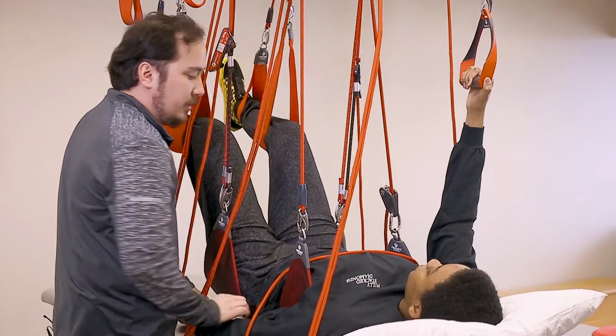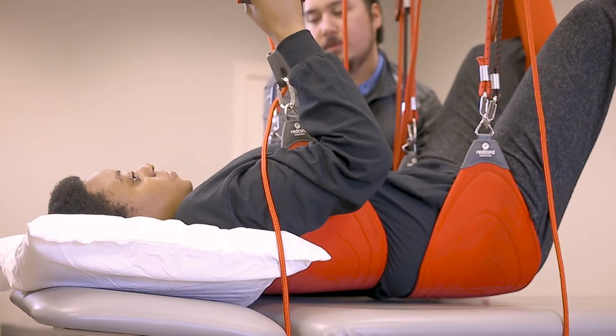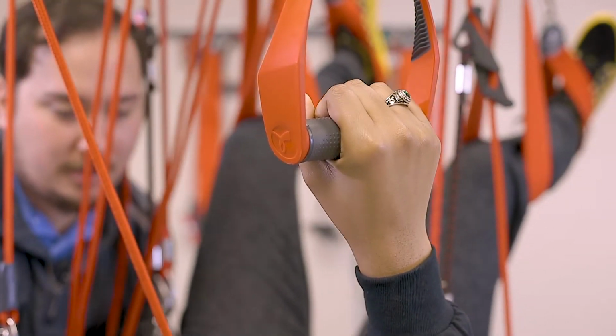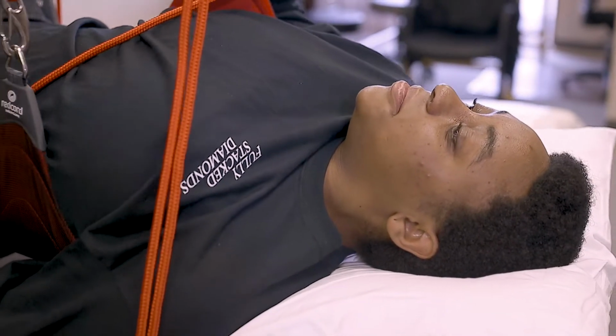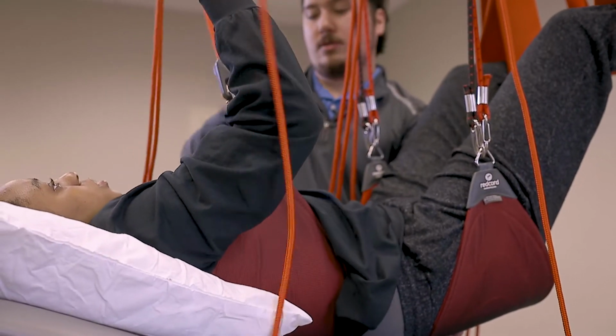The second setting we're going to use today is a supine lumbar setting with scapular retraction. And this is going to allow us to basically set the lumbar stabilizers and at the same time retract the right scapula, which will pull the thoracic spine neutral, and they're going to hold it there at that position. The reason we utilize this setting is a lot of times when you have a C-curve in the thoracic spine, the lumbar spine has to compensate. So it's real important that we engage this spine as well and normalize mobility and activation of the muscles in the lumbar spine while maintaining a neutral position in the thoracic spine.